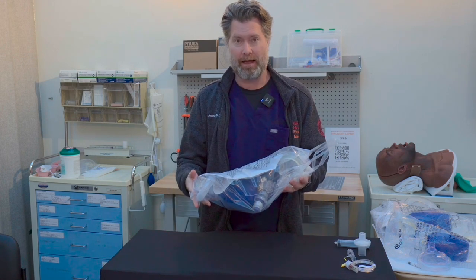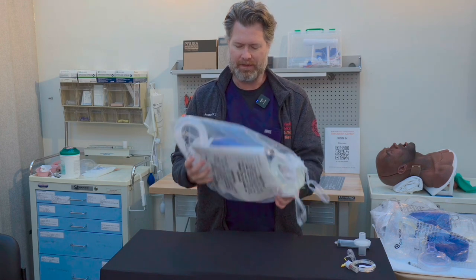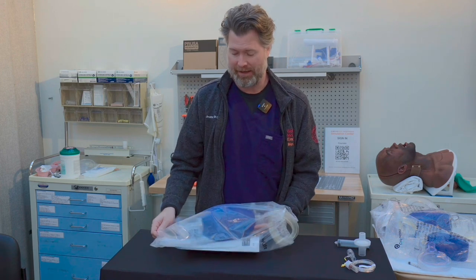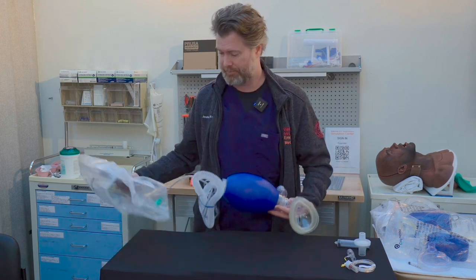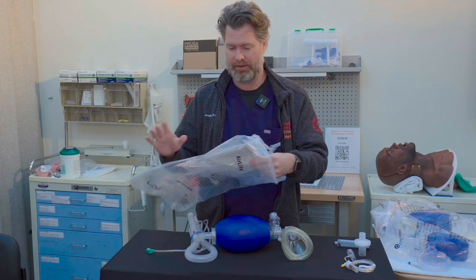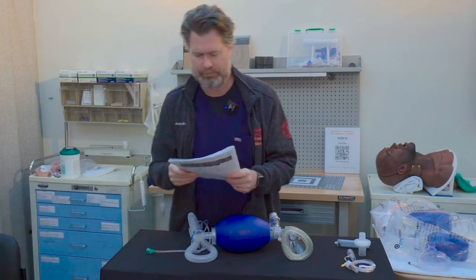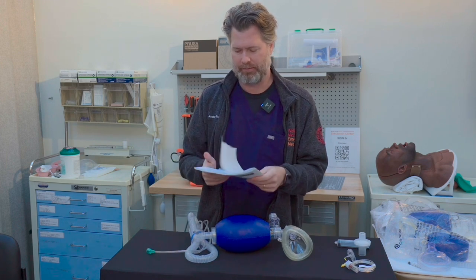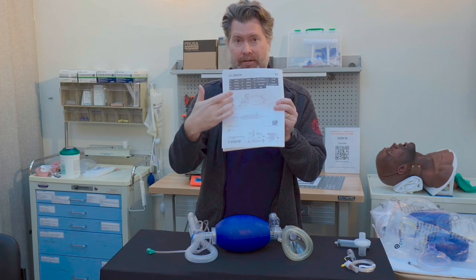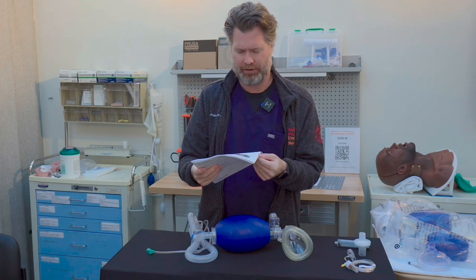Here we are. I have an Air Life BVM that comes in this plastic bag, and it usually hangs on a hook in every resuscitation bay that I know of. Inside we've got the BVM, and we actually have a manual — which I don't know if I've ever looked at one of these. This is the Air Life manual resuscitator. It's got a nice chart on the back that we can look at with all the parts.